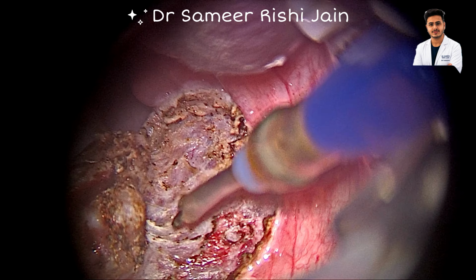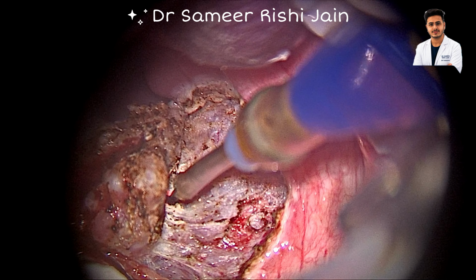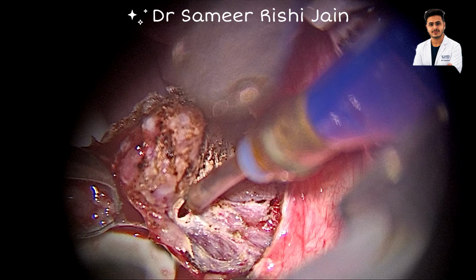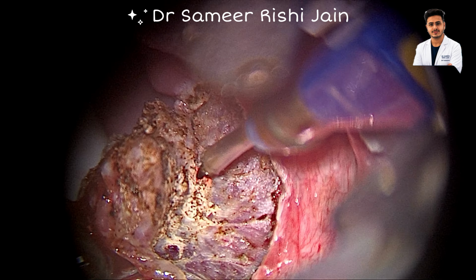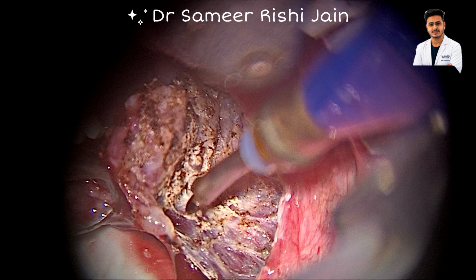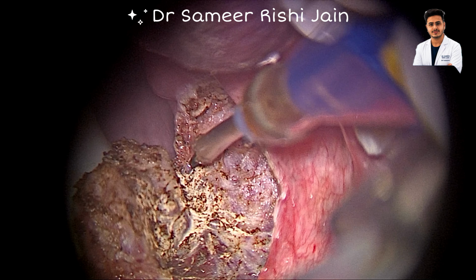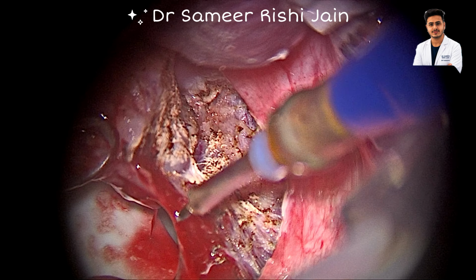We don't have to create a tunnel while removing the tonsil, as it will restrict our view. So we have to do equal dissection from all the sides, and the tonsil will open like a book on its own. We have to be a little cautious in not damaging the muscle, as more damage to the muscle will lead to more post-operative pain. We just have to divide at the junction of the tissue and the bed.